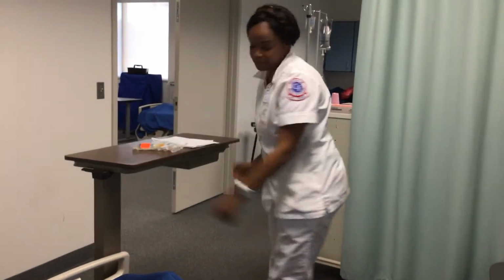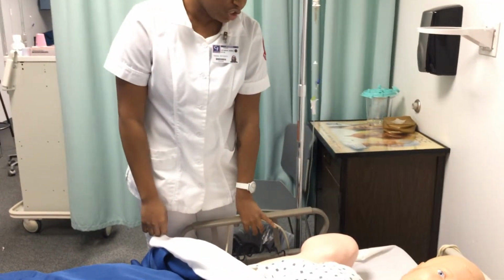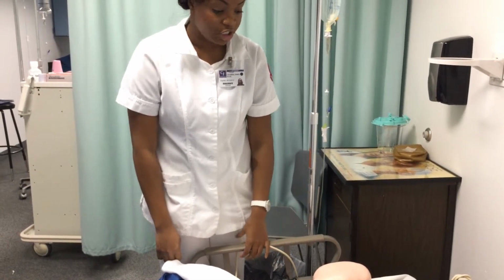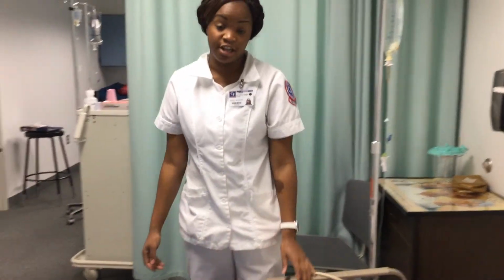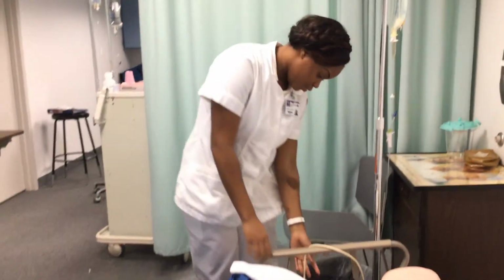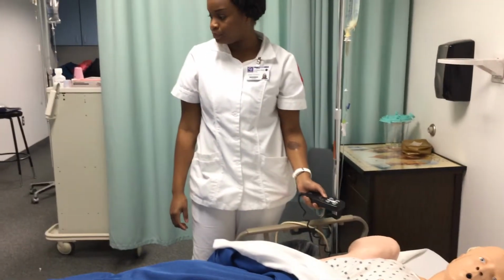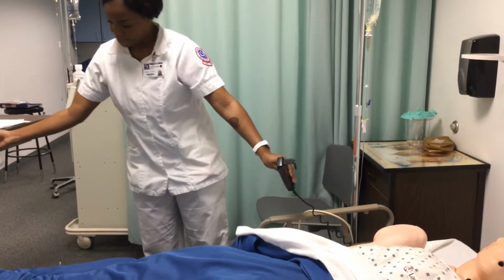It matches. Now, Ms. Jones, I'm getting ready to give you your IV medication, your antibiotic that the doctor has ordered. Now, do you have any allergies? Are you allergic to gentamicin or any other antibiotics? No. Okay, I've assessed the patient's allergies. She's not allergic to anything. I'm just going to go ahead and elevate the bed. My bedside table here.